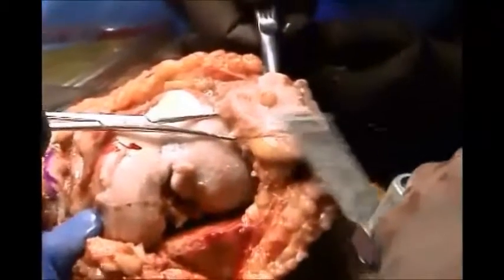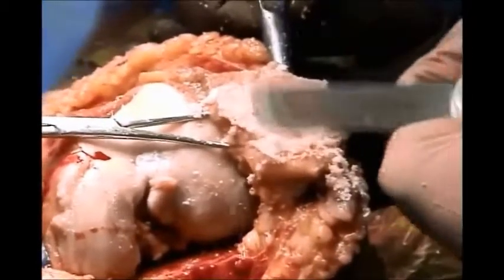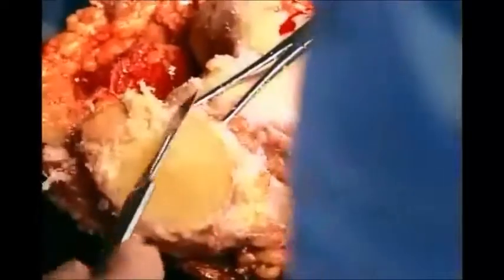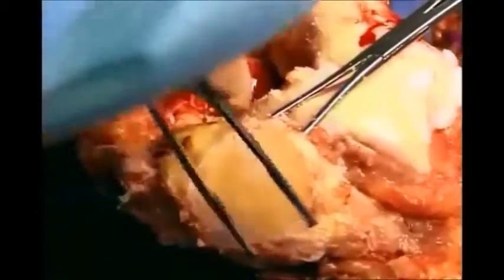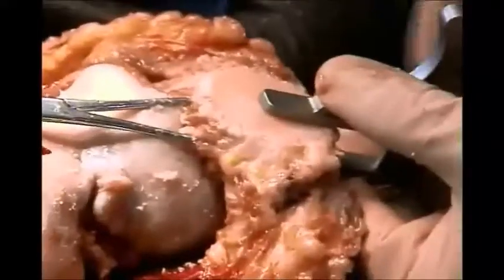Then you measure the patella and replace as much bone as is the thickness of the implant so that you don't overstuff. Also remove all the loose synovium and soft tissue around the patella. I do not use any jig — I cut the patella freehand.